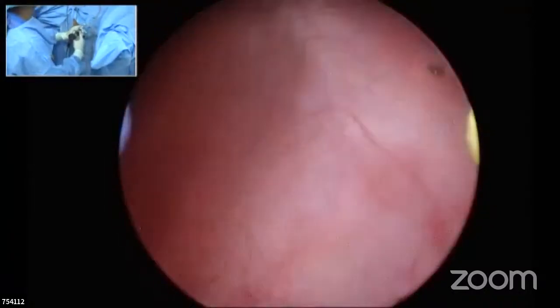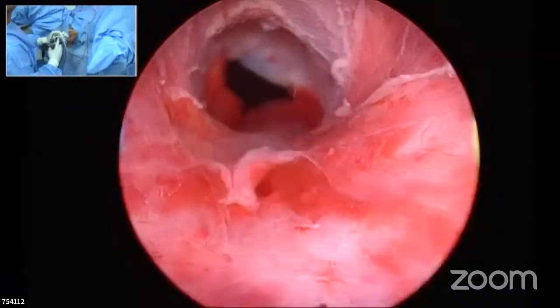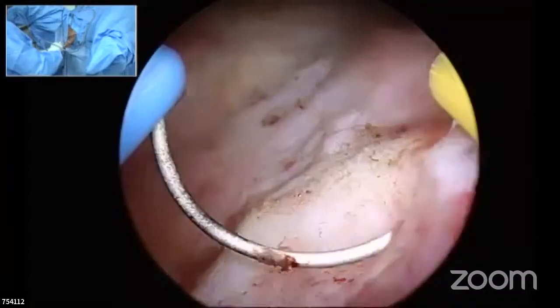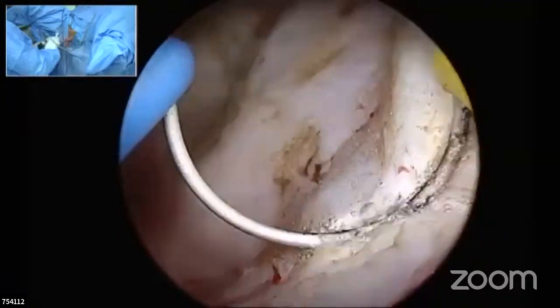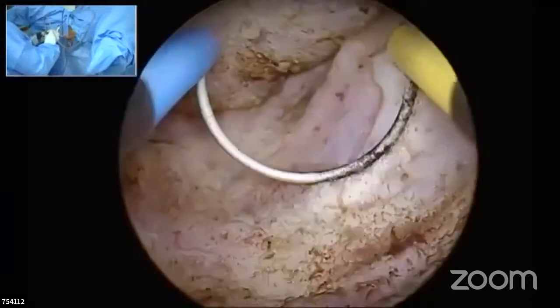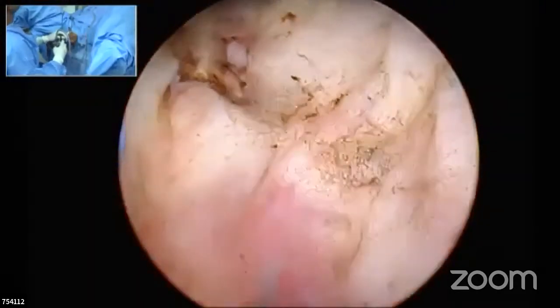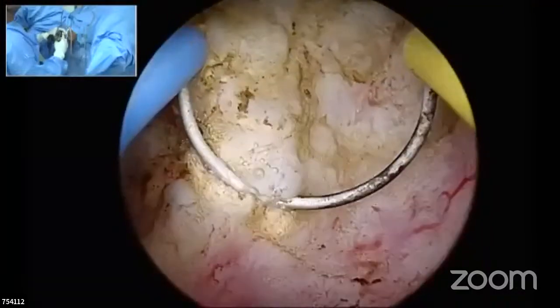Okay. I would like to mention that I will always put a small penile traction, as Dr. Wadhwa has taught me, so that while the patient is under spinal, when they come out of the anesthesia, they may jump and the bleeding may start. Your sister may not be very attentive in the ward. So to protect yourself for a few hours, by evening round, at 5 or 6 o'clock, we take out that traction.